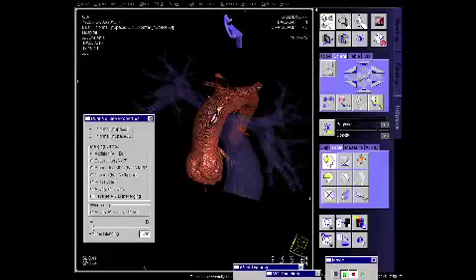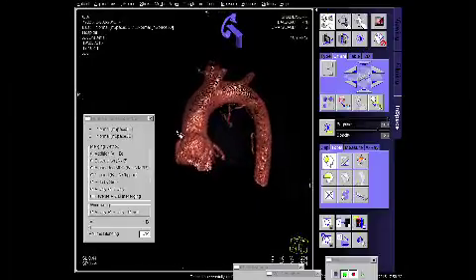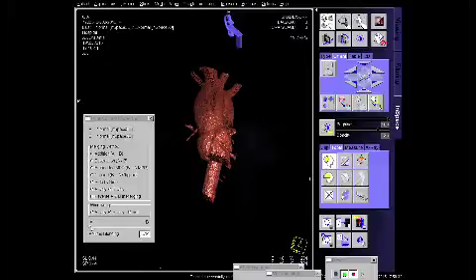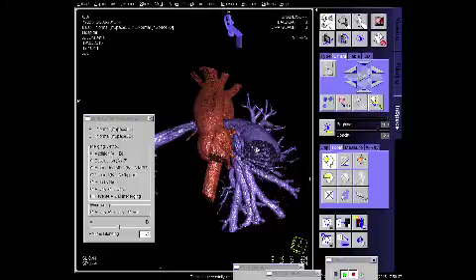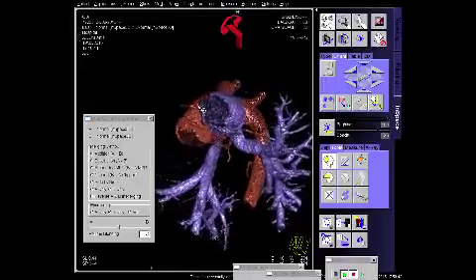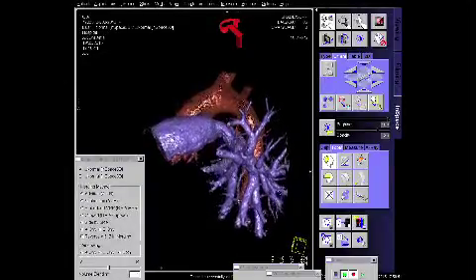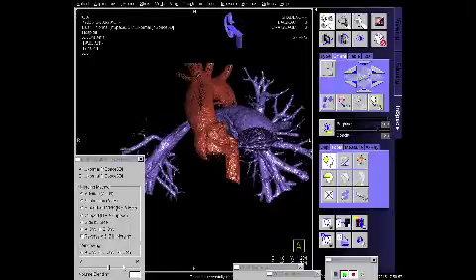If you now blank the aorta away, one comment we made before: you may see a coronary artery just below the pulmonary arterial trunk. If you show again the pulmonary artery and the left coronary artery, they are quite close, so we should take this into account in the future if for any reason we need an implantation of a pulmonary valve. But this is not the problem today. That's one example of the topography which is visible if you use 3D like this and get all the information in one run.